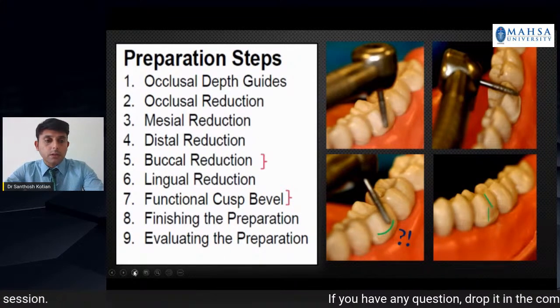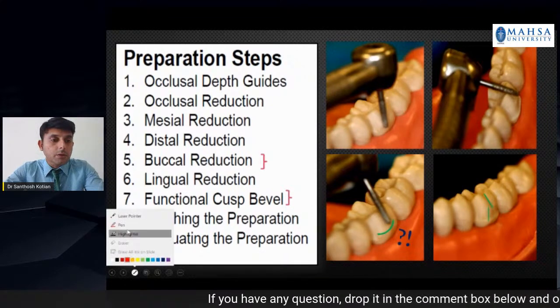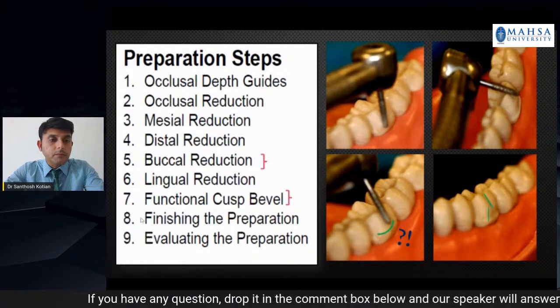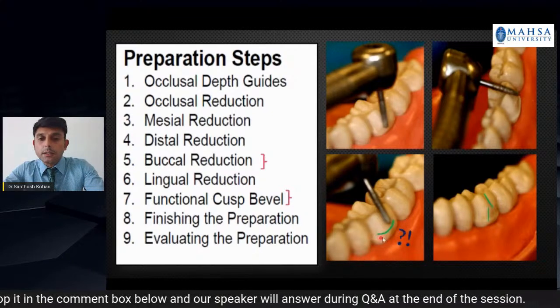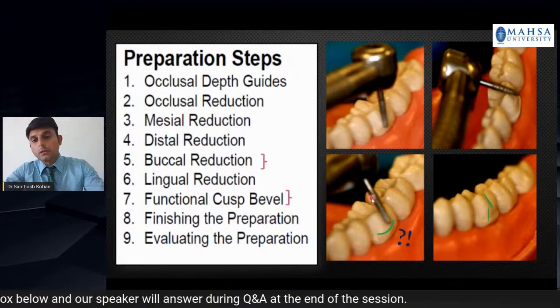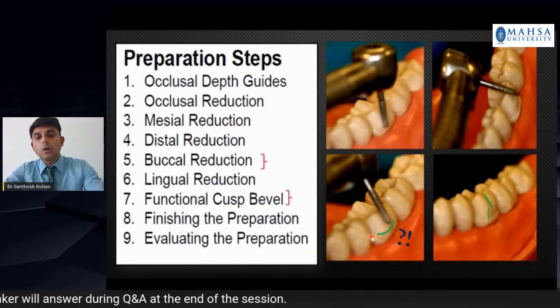I hope the cursor is seen. I'll just put on the laser pointer. Okay. This is something that I don't recommend: using the tip of the burr on the middle of the surface.